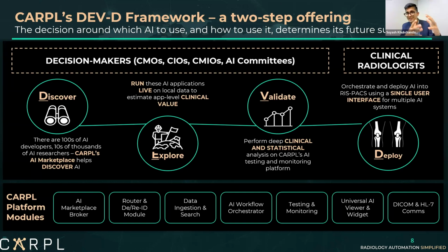Now, because that is still sitting as part of the patient jacket and PACS being immutable, it's constantly going to be there, available for any referring physician, any patient who has access to their EMR, has access to their PACS records to access. And this can potentially pose challenges if it is subpoenaed or if there's a review of that medical record.